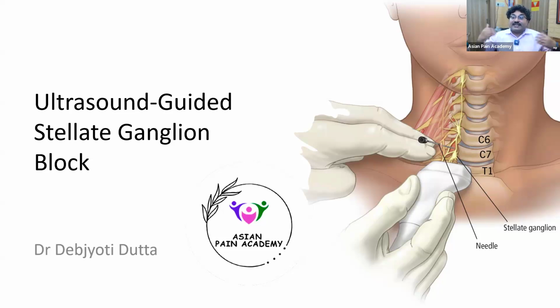So then the technique changed under fluoroscopy. A new technique came up, known as the oblique technique. Under the oblique technique, just the posterior part of the foramen is focused, and just below, at the junction with the base of the uncinate process, a little drug at the level of C6 is injected. So that became the standard technique.